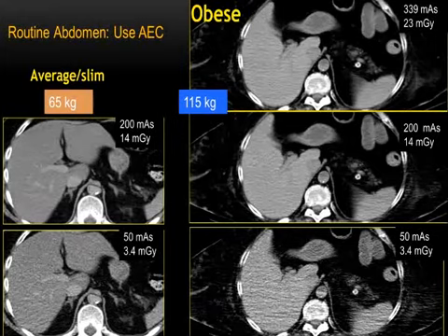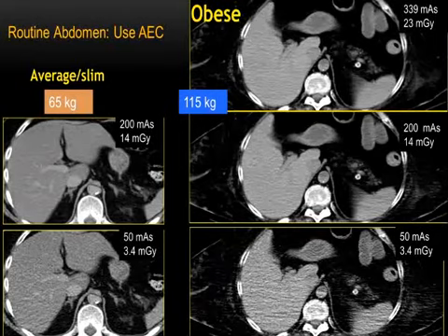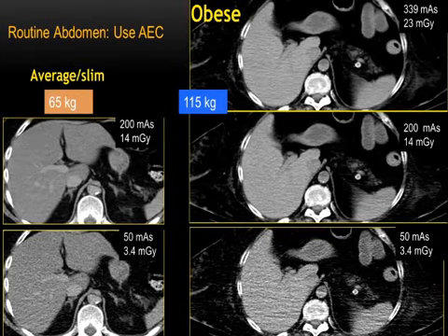You can see that in all of my talks, I always start from clinical indication. The number one golden rule is justification of the exam. The number two thing that we do for protocol optimization is not the size of the patient, but why the scan is being done. And then the third thing, which the vendors actually do a brilliant job at, is sizing the dose for the patient size. Right? And that's why I have it lower in the priority.